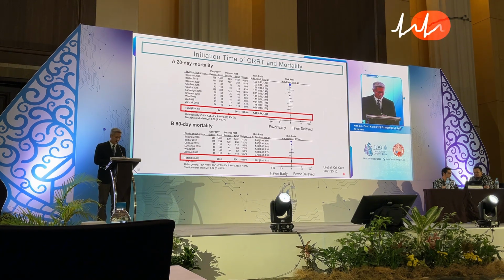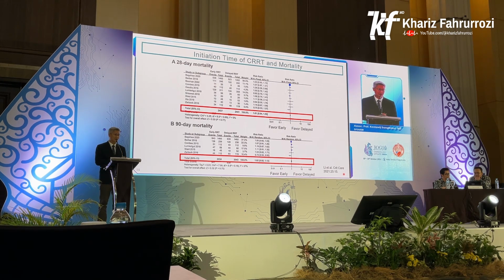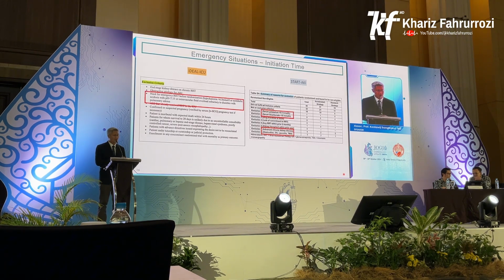In regards to initiation time, you can see from this picture that both 28-day and 90-day mortalities look similar when comparing early intervention and late intervention. However, I would like to show you that in cases with an emergency situation, for example, I'll show you the exclusion criteria from the IDEAL-ICU and STARRT-AKI studies.